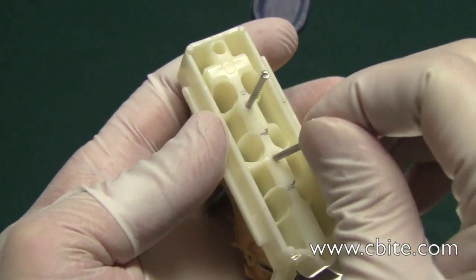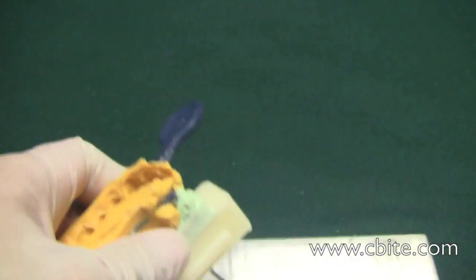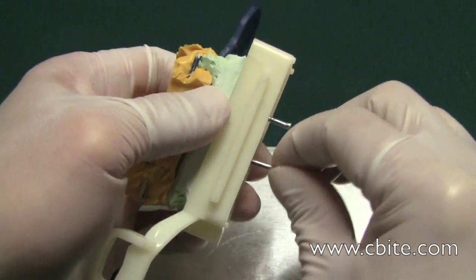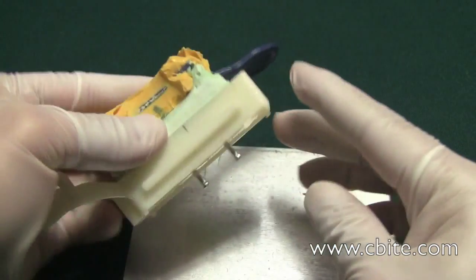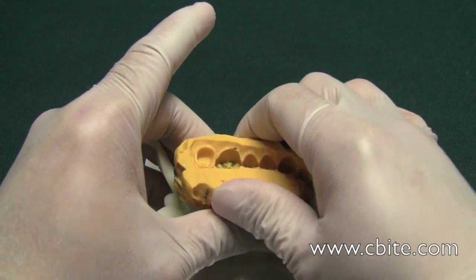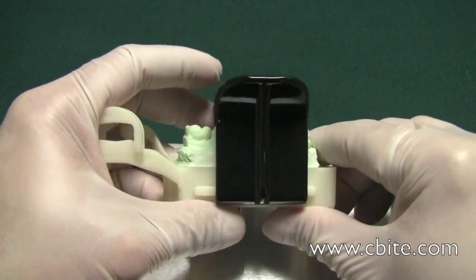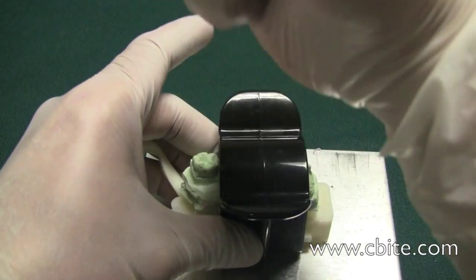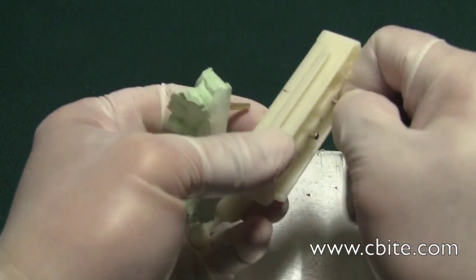With the pins in place and pretty much level, you could use a rubber mallet or your fist, which basically ejects it. It ejects the model cleanly, and then you just need to remove the ejector pins.